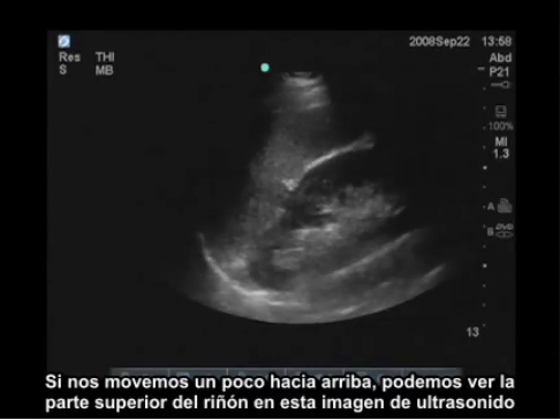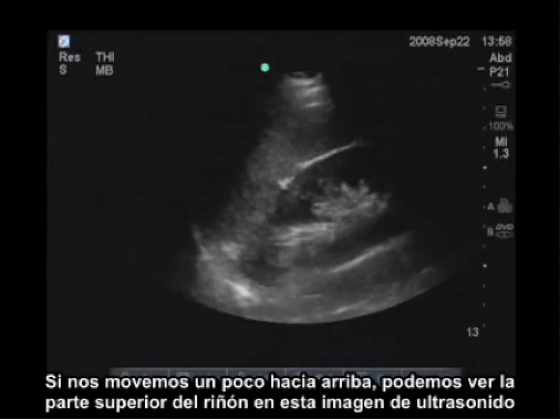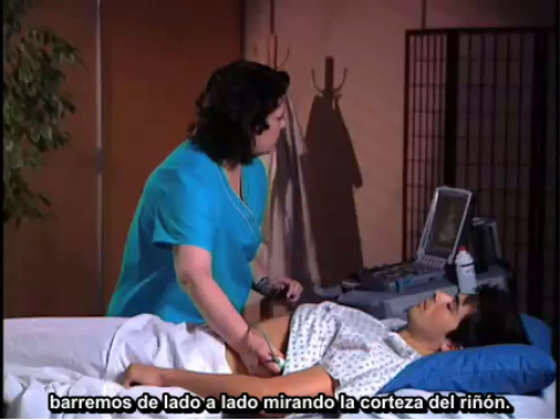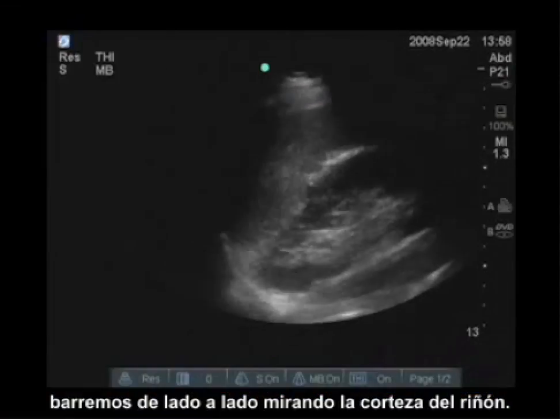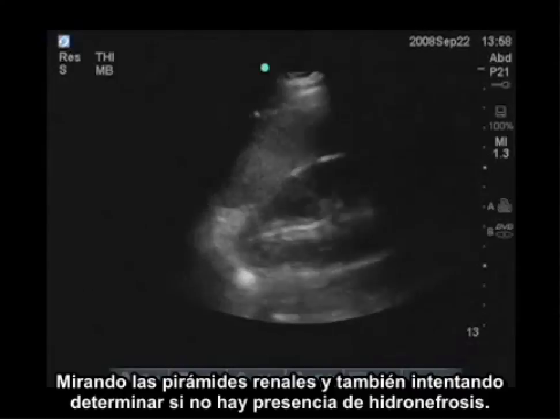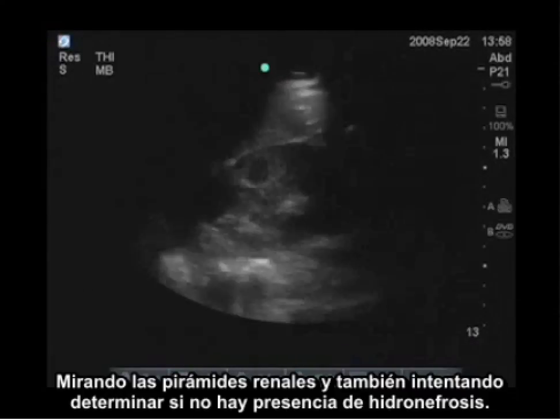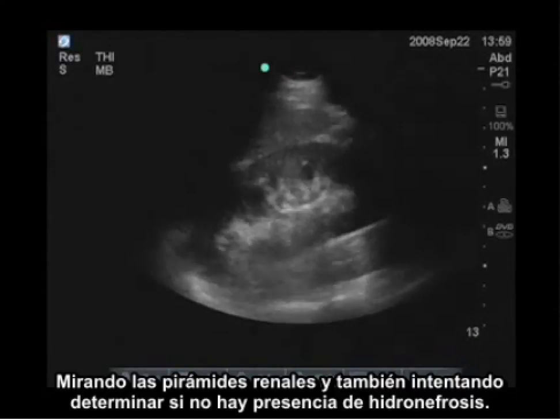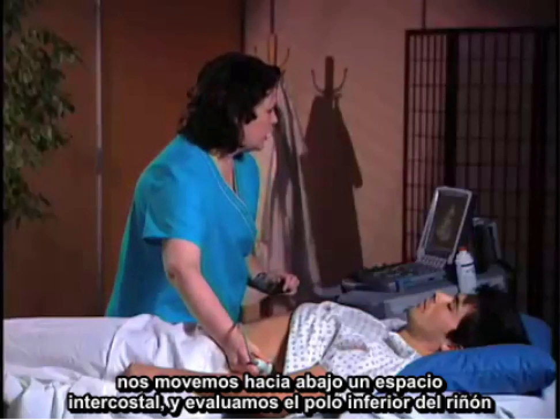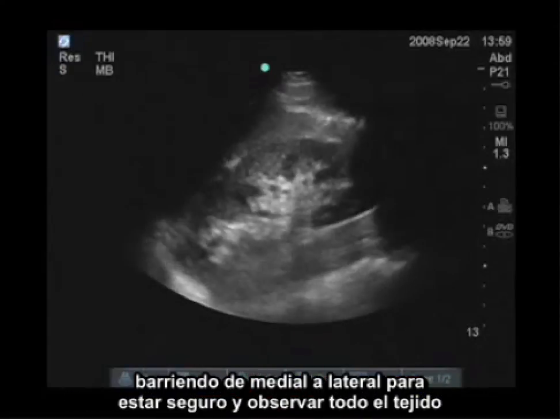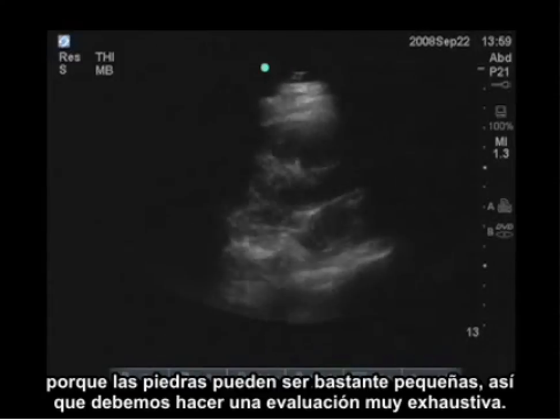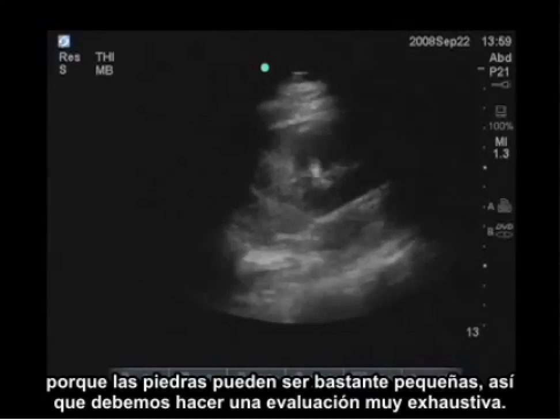If I move up a little bit, I can see the superior part of the kidney on this ultrasound image and I'll just sweep from side to side. Again, looking at the cortex of the kidney, looking at the renal pyramids, and also trying to determine if there is hydronephrosis present. Then I'm going to move down one rib space, evaluate the lower pole of the kidney, and sweep medial to lateral to make sure I've looked at all of the tissue, because these stones can be quite small, so you have to do a very thorough evaluation.